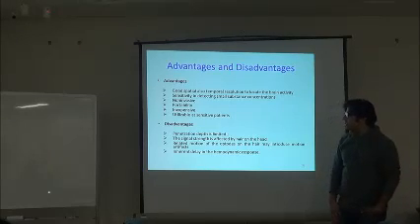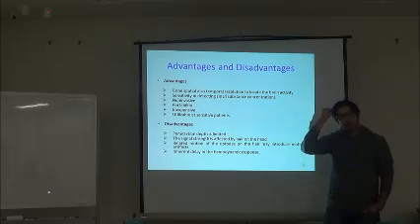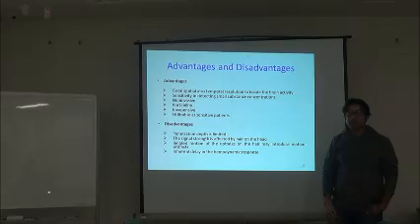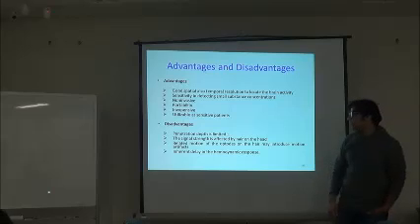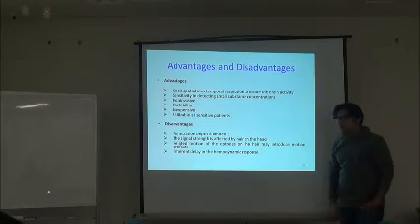The second one is that the signal strength is affected by the hair on the head. As I told you, the near-infrared wavelength is of the same scale as our hair or a point of pin. So the hair can affect the near-infrared waves, and also the absorption because of the hair. So the hair artifact is there.